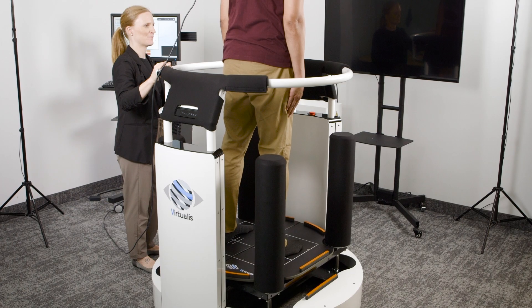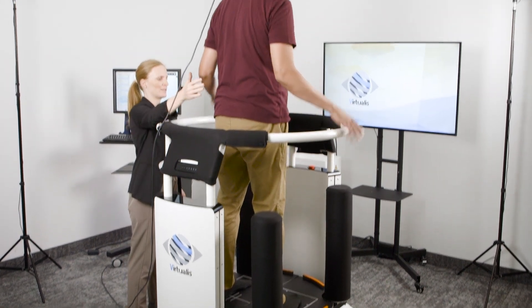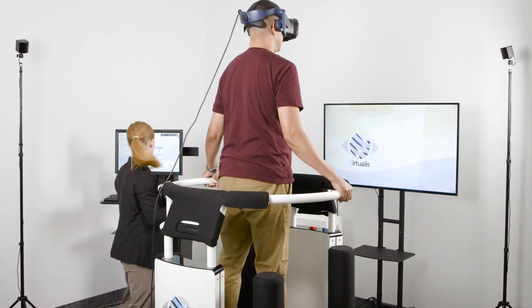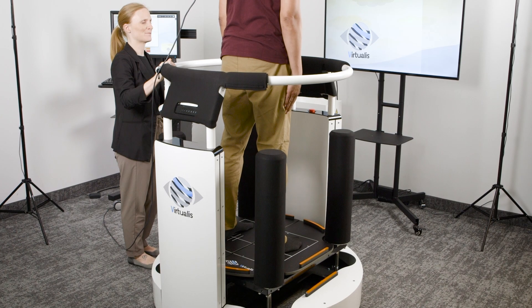Once condition five is completed, tell the patient to open their eyes. The final sixth condition includes a sway-referenced condition on an unstable surface.